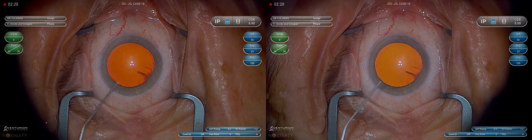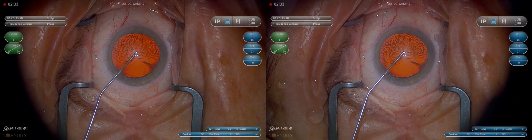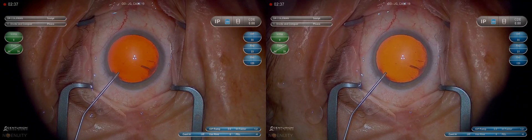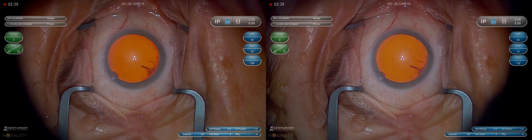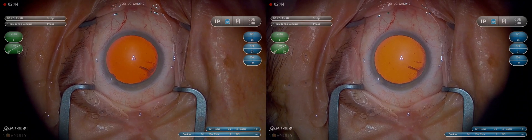Here is Viscoat. We'll come across the eye and then burp the lidocaine back out through the paracentesis. Try to get a complete fill, but the eye doesn't have to be too hard, just firm — trying to avoid causing too much discomfort to the patient, but get it firm enough so we can make a good main wound.